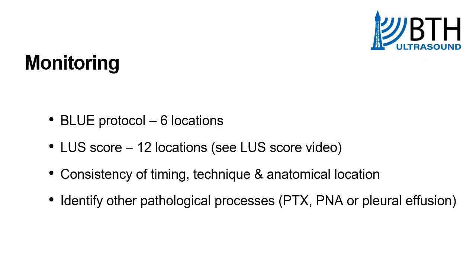And also, this patient is suffering from COVID-19, but that may not be the reason that they have significant respiratory symptoms, or if their symptoms worsen or improve, it may be due to the development or resolution of other pathology. So just because somebody has COVID-19, it doesn't mean to say that they won't get pneumothorax or pneumonia or pleural effusion. So definitely monitoring those patients regularly to make sure it's still the case that the COVID-19 is the most prolific pathology that's affecting the patient, but to keep an eye out for other potential differentials of pathology involvement as well.